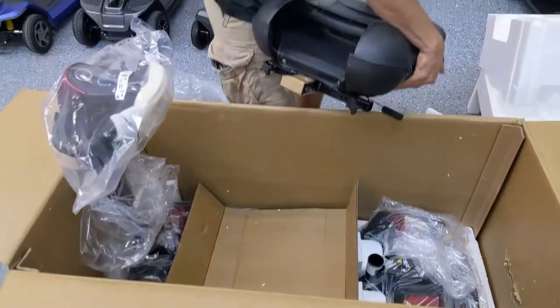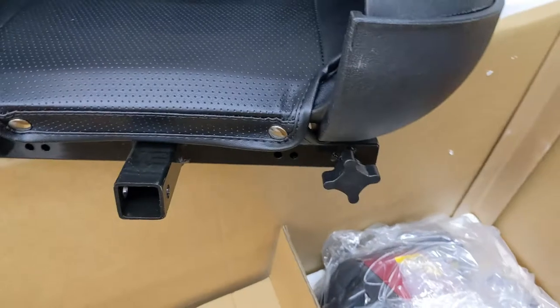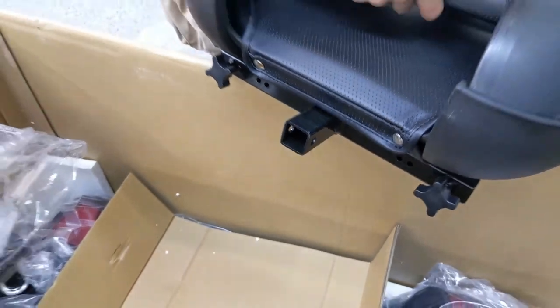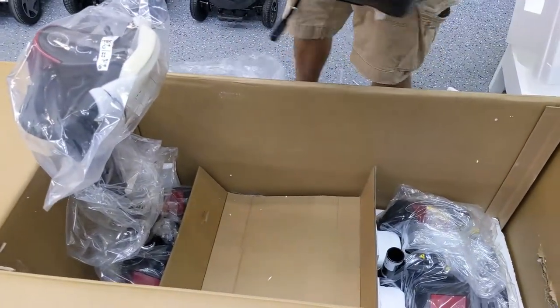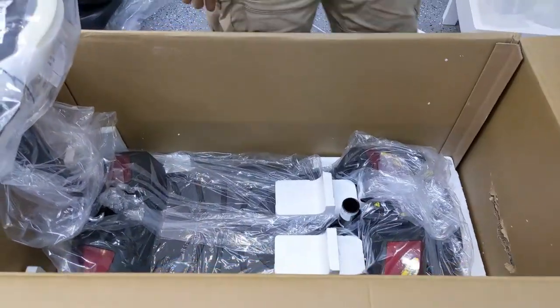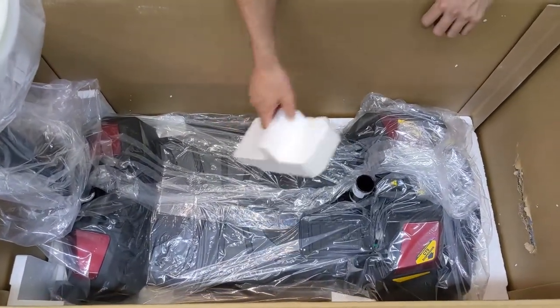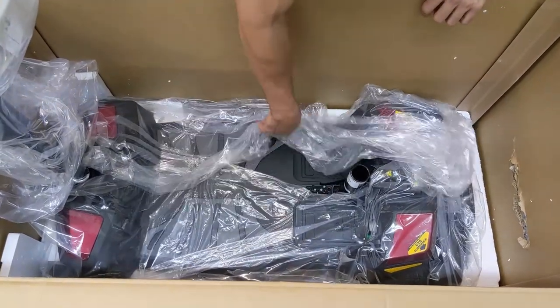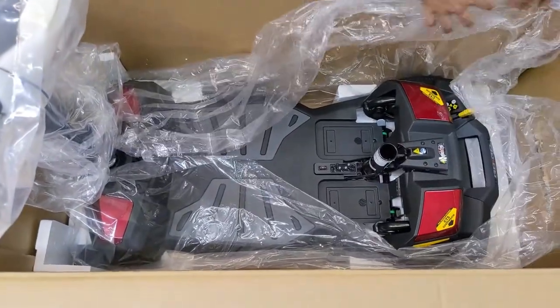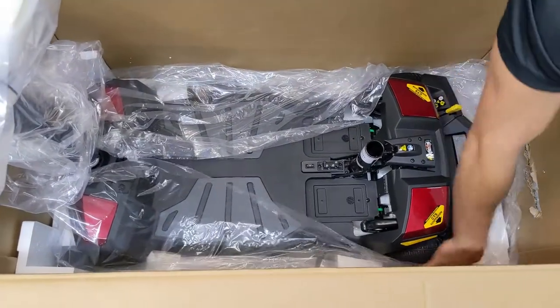On the back, there is an accessory port which is covered by styrofoam. You can use that to put a rear basket, cane holder, crutch holder, oxygen tank holder, and many other accessories that work with that one-inch universal accessory port. I'll begin removing the last piece of cardboard and the last few pieces of styrofoam. They've even put styrofoam right over the battery terminal area to keep that protected. It seems like they're improving the packaging process every year.